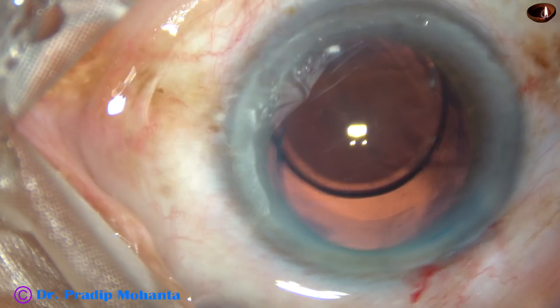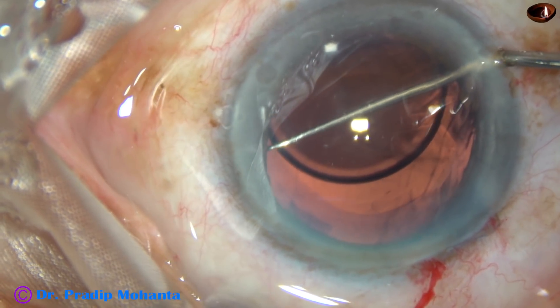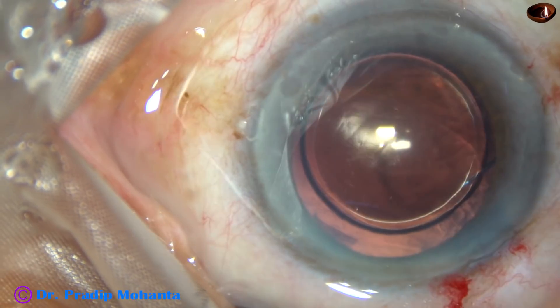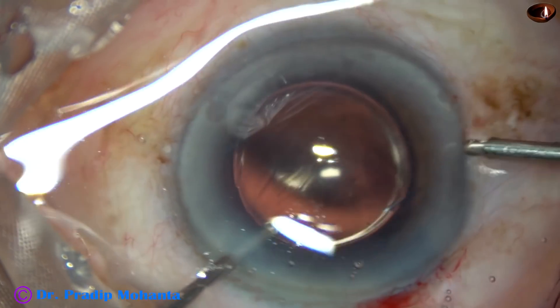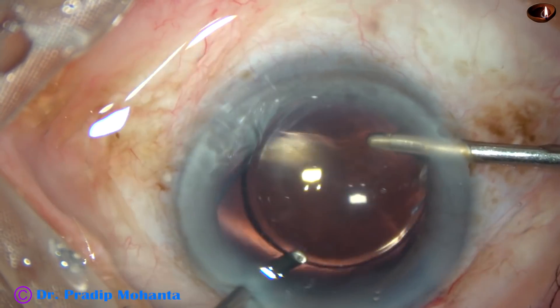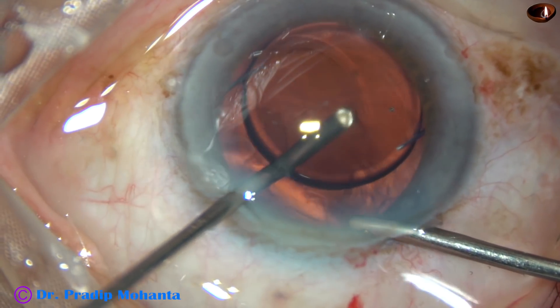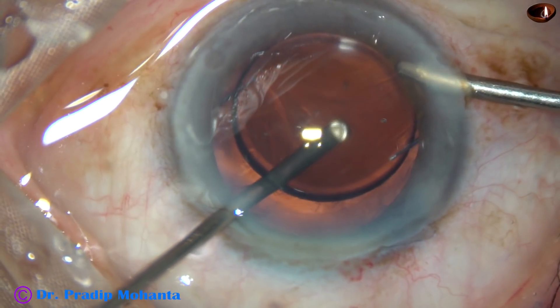The haptic didn't go into the sulcus — it is over the iris. So what I do is take a Sinski hook, go through the right side port, engage it at the haptic-optic junction, rotate it, and it goes into the sulcus. Since the rhexis was large, about 6 mm, I cannot do optic capture. Now I am going to use the cutter and irrigation for removal of visco, because I do not know if at any moment any vitreous strand will come or not. I have gone into the anterior vitreous and am using the cutter to remove the viscoelastic substance from the anterior vitreous, using irrigation intermittently.